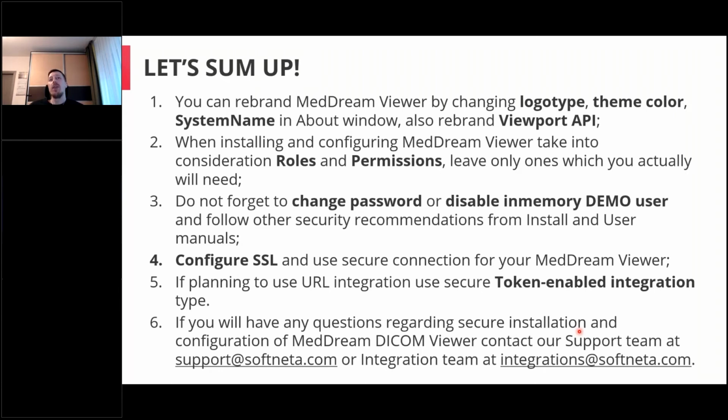And when you install it, don't forget to disable, or if you will not disable, then at least change the demo user, the password and the username, for security, and also follow the other security recommendations which were mentioned in the slides. There is a section for this in the installation manual.